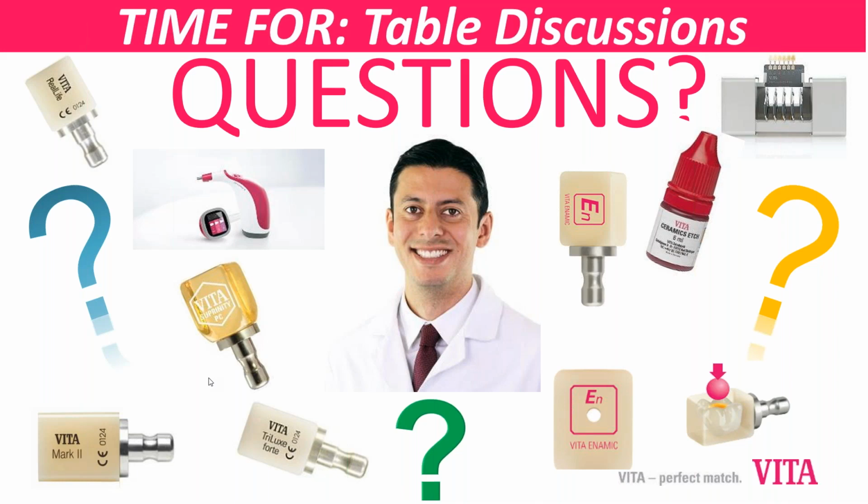We just think that it's putting the bisacryl and scanning it that quickly, but then your stitching is not great, your biocopy is not going to work, because the difference on the cervical between what you have in bisacryl and your initial scan is too different. So yes, we need to try to have the best putty matrix.